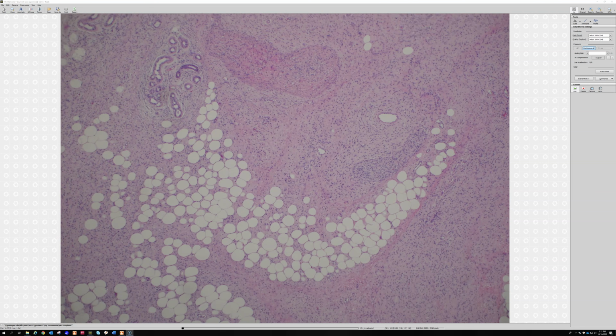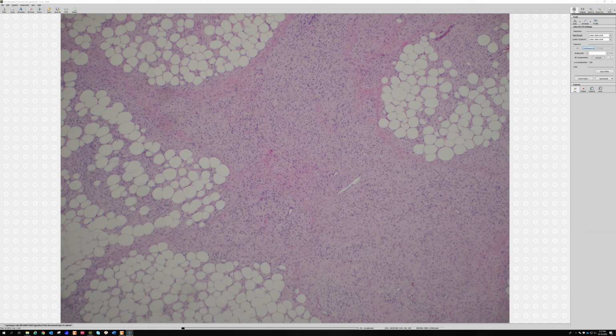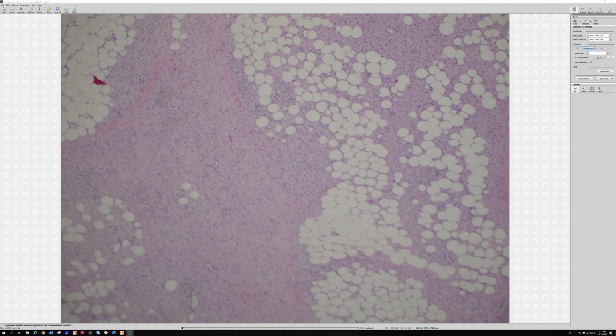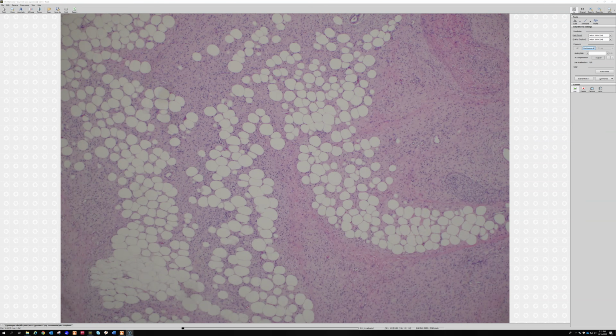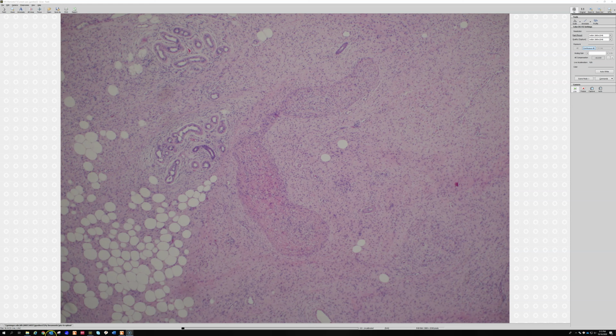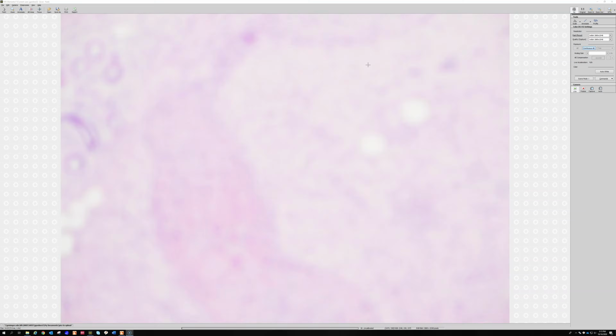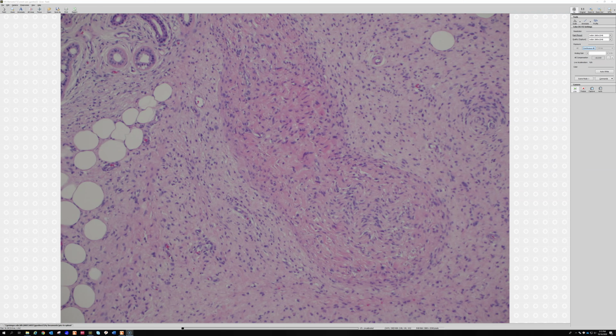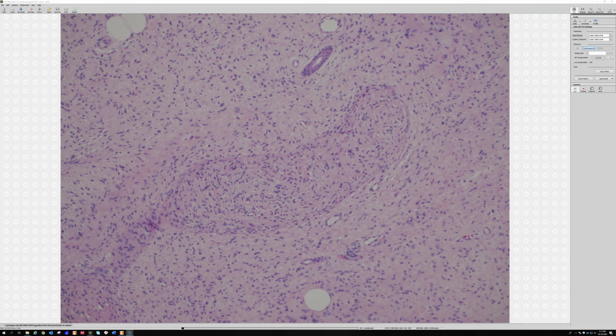This is a diffuse neurofibroma, which can often entrap fat, sometimes extensively. And I think it's really important to know about this because a lot of people forget that neurofibromas often express, the majority of them will express CD34 because there's a background dendritic cell component. This case also has a couple of these little elongated, expanded nerve trunks, which are also filled with neurofibroma. And in fact, this patient had NF1, unfortunately. And so this is a tiny little bit of plexiform neurofibroma mingled in with this diffuse neurofibroma.